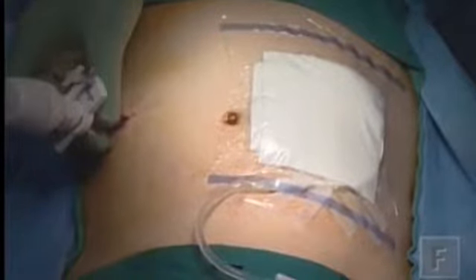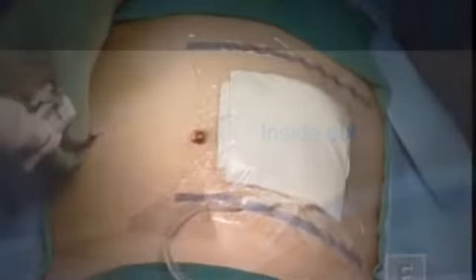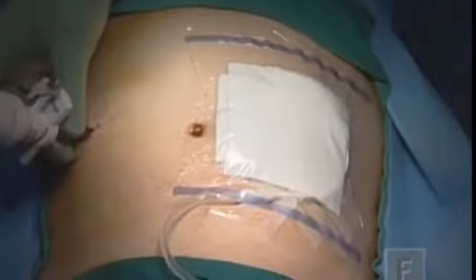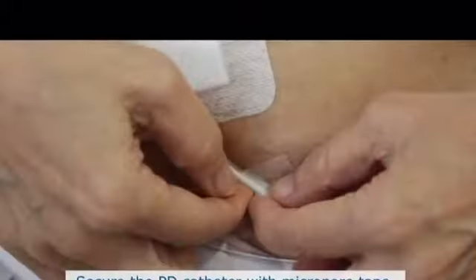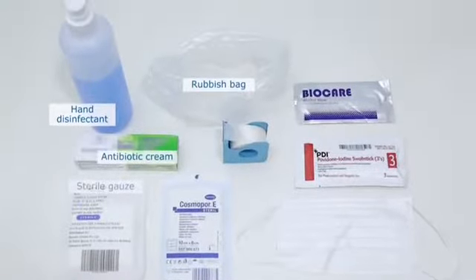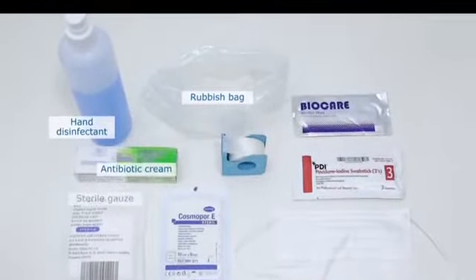For dressings, gauze and or transparent semi-permeable dressings are most frequently used. Routine dressings are optional. Dressings are indicated when the exit is likely to become dirty and when the exit site is infected. Dressings may help to secure the catheter, and the catheter or proximal connecting tubing should be secured to avoid tension and traction during procedures, as well as accidental trauma. Devices are available to secure the catheter.